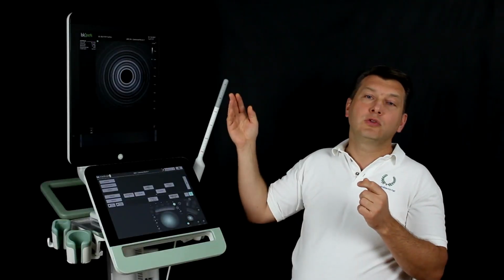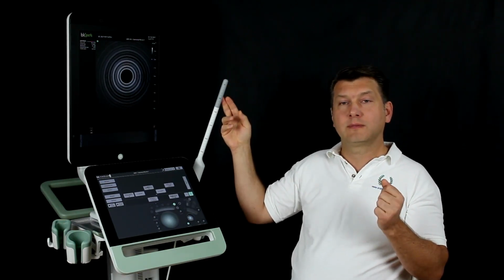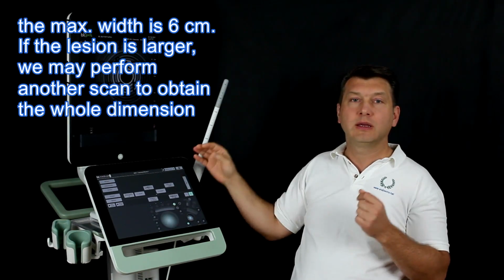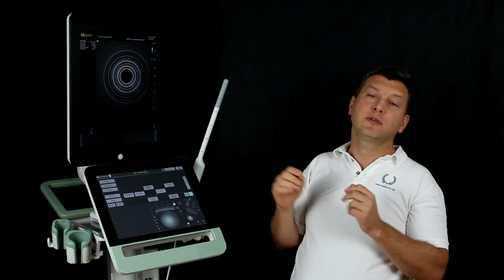The width should be chosen in such a way that the entire lesion is covered. It is crucial to note that our probes have a maximum of 6 centimeters ultrasound detecting range. If the lesion is bigger, the examination must be performed several times.